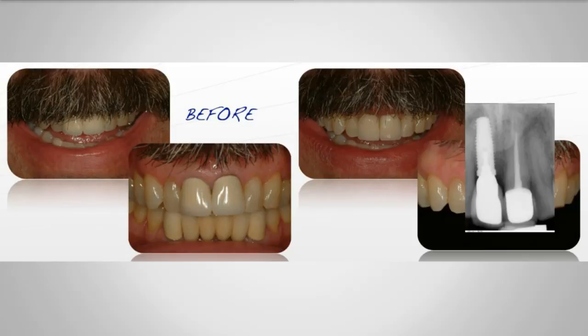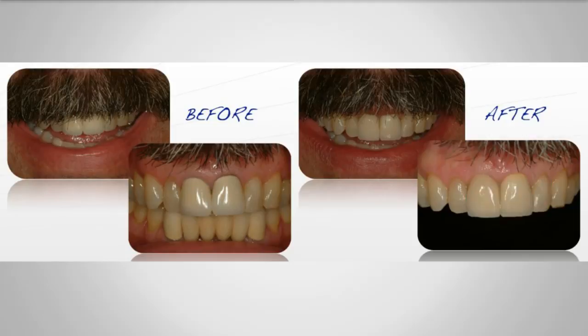And I've got a question, is that a 3i performance post? It's a 3i performance cylinder. In Frank's case, the post is used for cement retention, which I don't necessarily recommend.